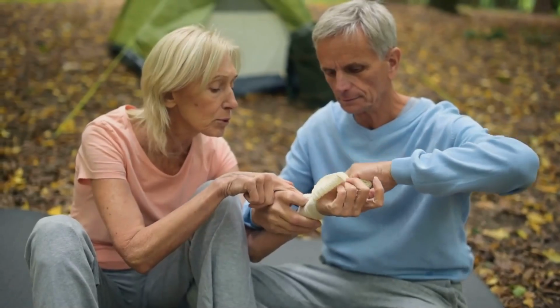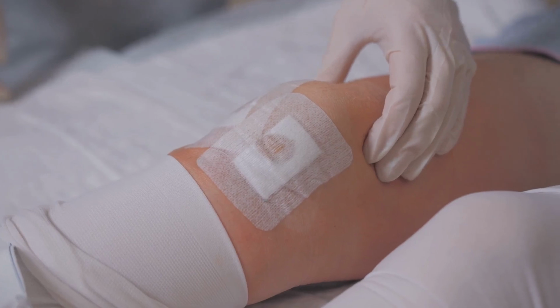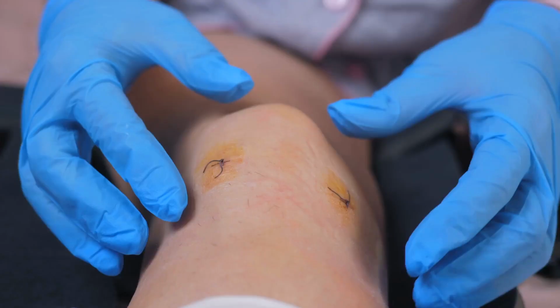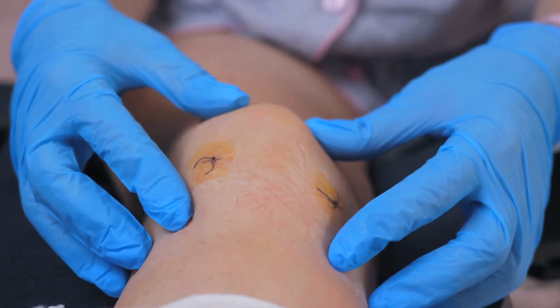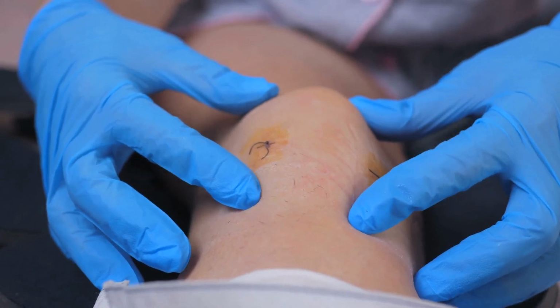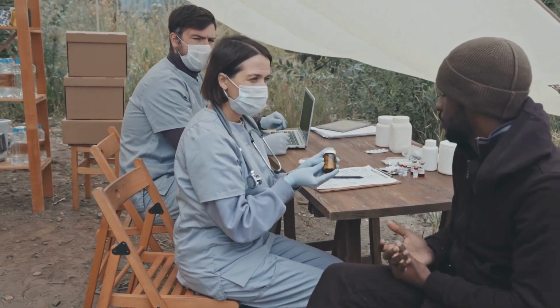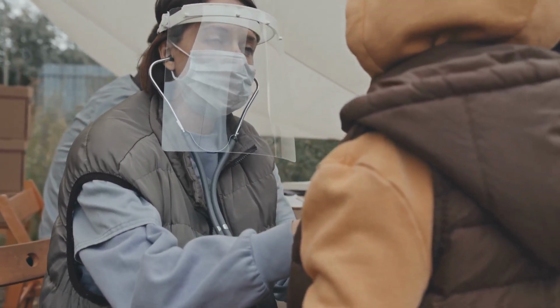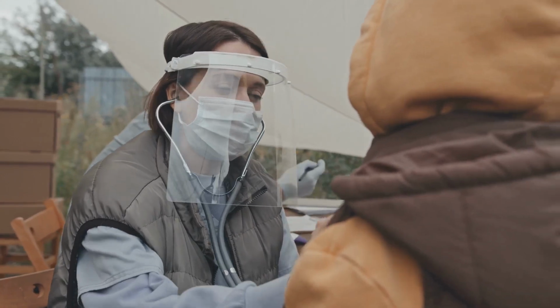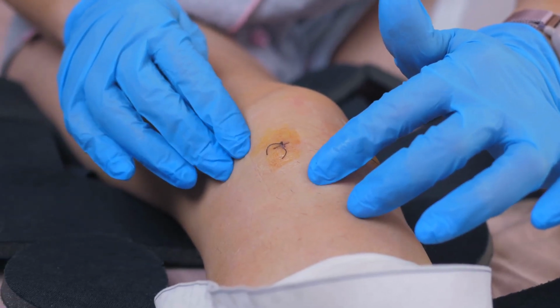It is essential to ensure complete coverage of the wound with the amniotic membrane. The DHAM is then covered with a protective dressing to keep it in place and maintain a moist wound environment. The frequency of DHAM application may vary depending on the severity of the wound and the patient's individual healing progress. In some cases, multiple applications may be necessary to achieve complete wound closure. Regular follow-up appointments are crucial to monitor the healing process and make any necessary adjustments to the treatment plan. The physician will assess the wound at each visit and determine if reapplication is required.